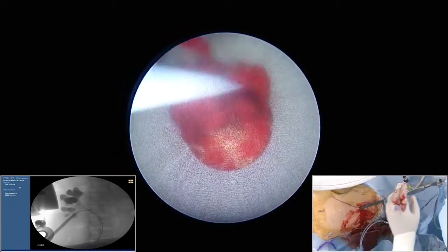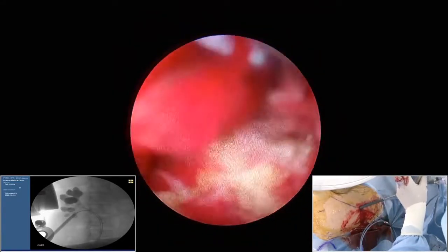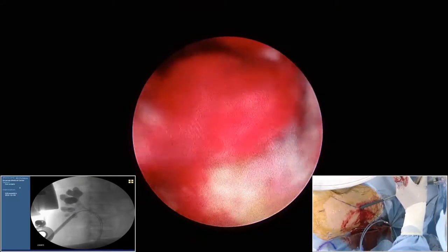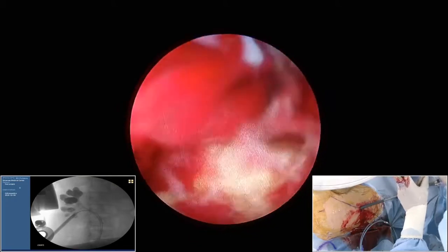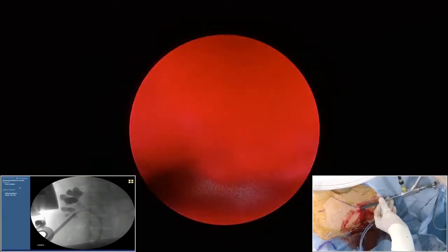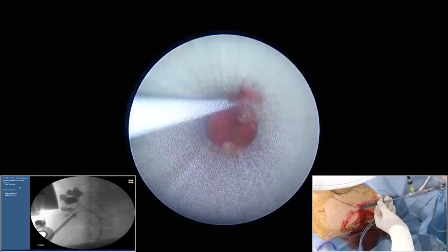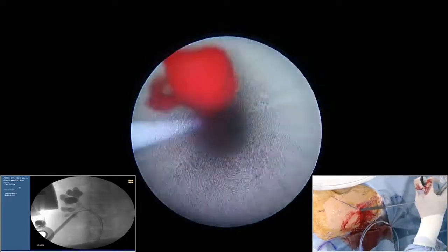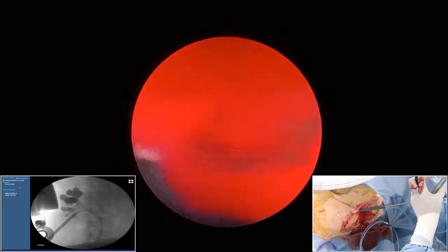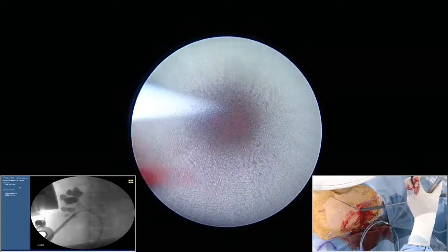So I'll put a collector. How to remove this on the abdomen? Blood clots? Yeah, blood clots, maybe. So just next to the stone. Usually these clots can disappear easily, so please give me the laser fiber. I'm using the 550 micrometer laser fiber.